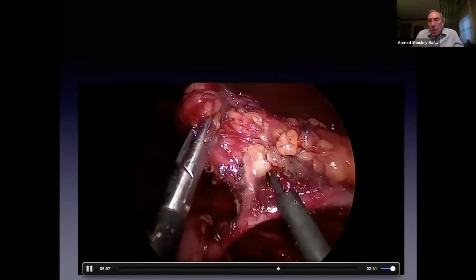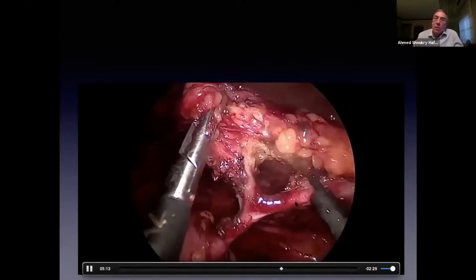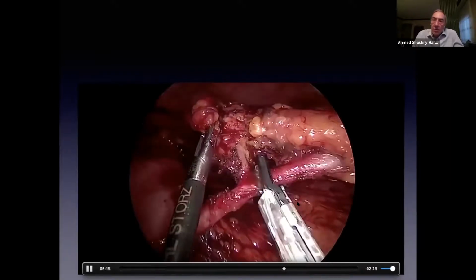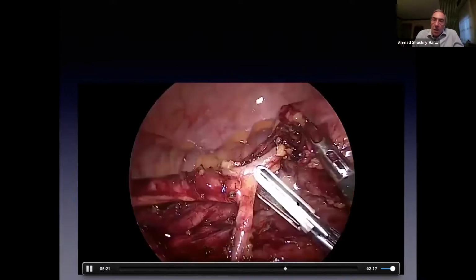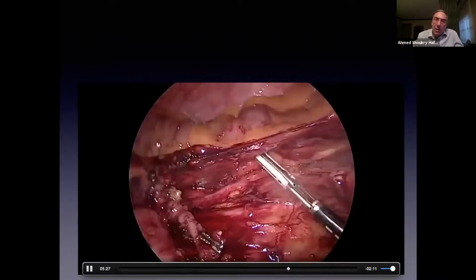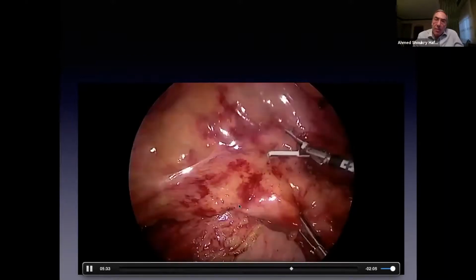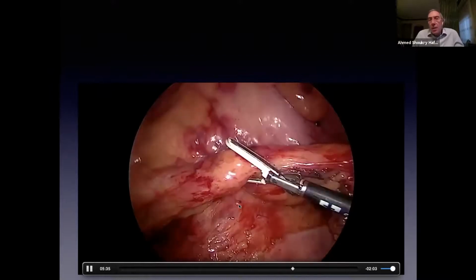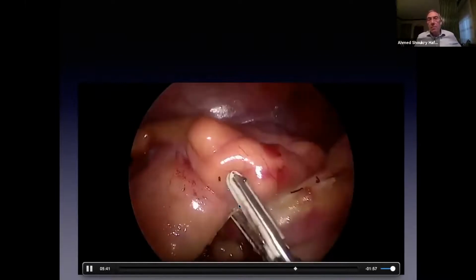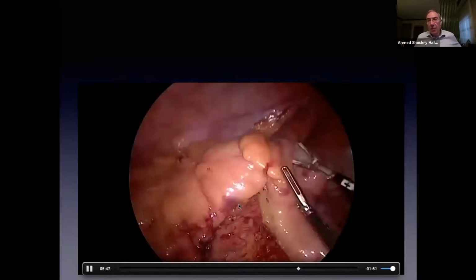So now we are going to ligate the inferior mesenteric artery after the takeoff of the left colic artery. Now this is the vein again. We ligated the vein again downwards, and now you have here the released lymphadenectomy specimen and the remaining part of the vessel. The final step in our resection is cutting down the mesentery to the colonic wall at the suggested area for the anastomosis.